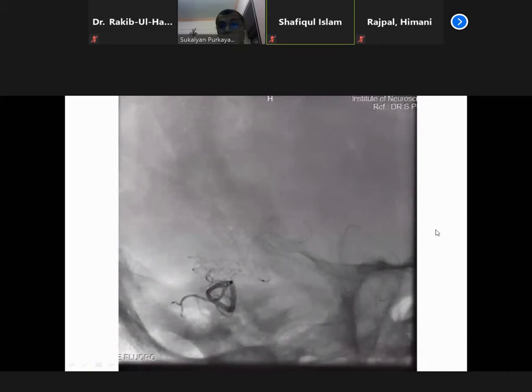And also there was some fear in my mind, because you exactly do not know where this vein, the foot of the vein, is going. So once the foot of the vein starts, you stop. Exactly where that vein is, if any normal vein is coming here or not, you can't be 100% sure. So obviously I put the patient on some anticoagulant, although it was a bit low. It was, I think, 2,500 of Fragmin.